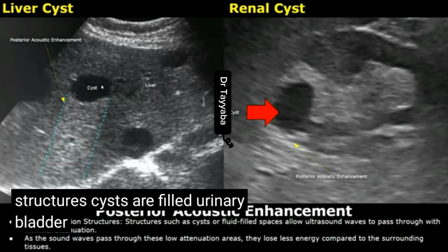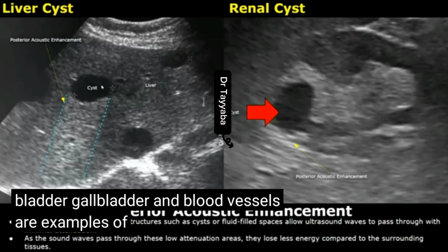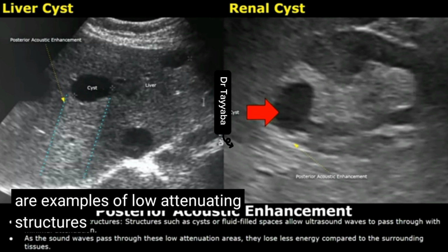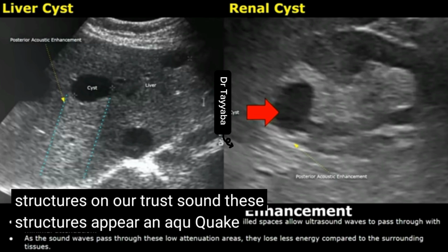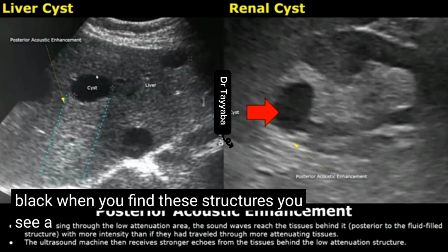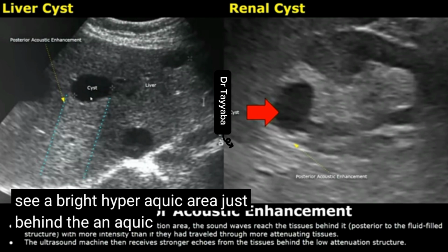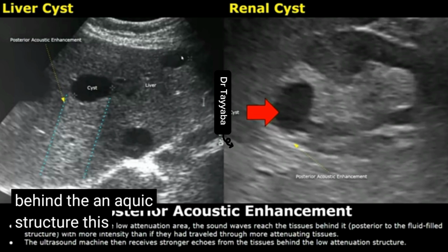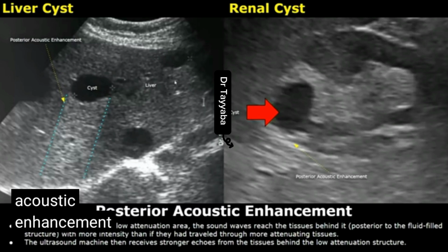Cysts, a filled urinary bladder, gallbladder, and blood vessels are examples of low attenuating structures on ultrasound. These structures appear anechoic or black. When you find these structures, you see a bright hyperechoic area just behind an anechoic structure. This bright area is the posterior acoustic enhancement.